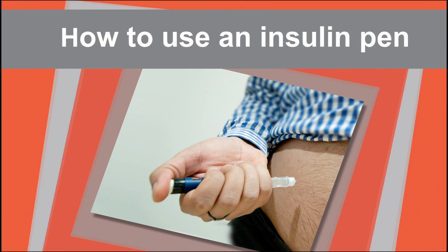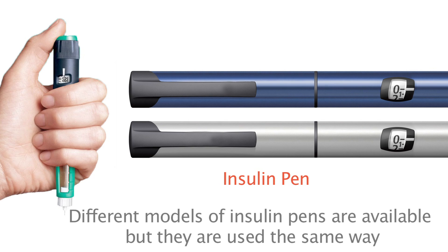Let's learn how to use an insulin pen. This is what an insulin pen looks like.